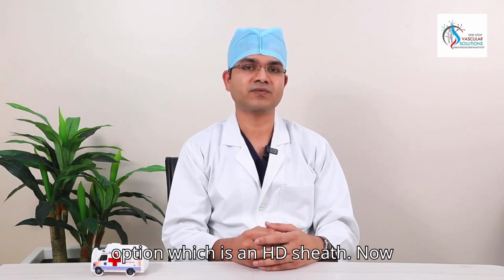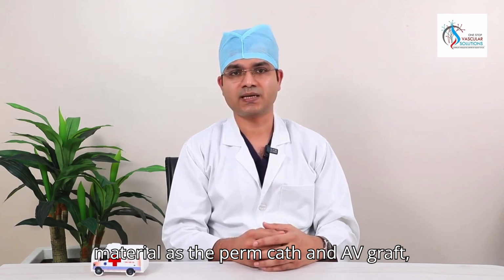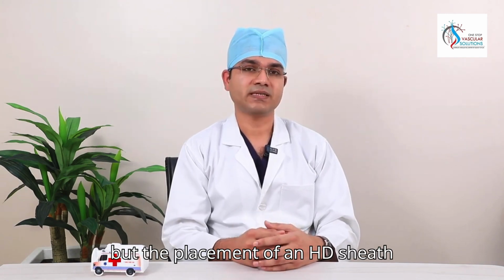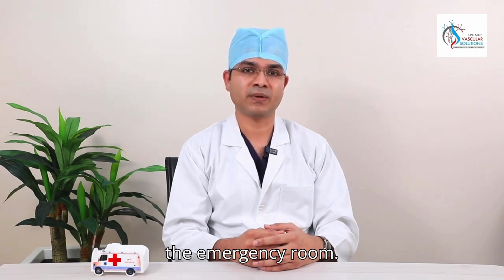The third option is an HD sheath. HD sheath is also made up of a similar material as the perm cath and AV graft, but the placement of an HD sheath doesn't require any OT setting. It can be done in emergencies in the ICUs or in the emergency room.